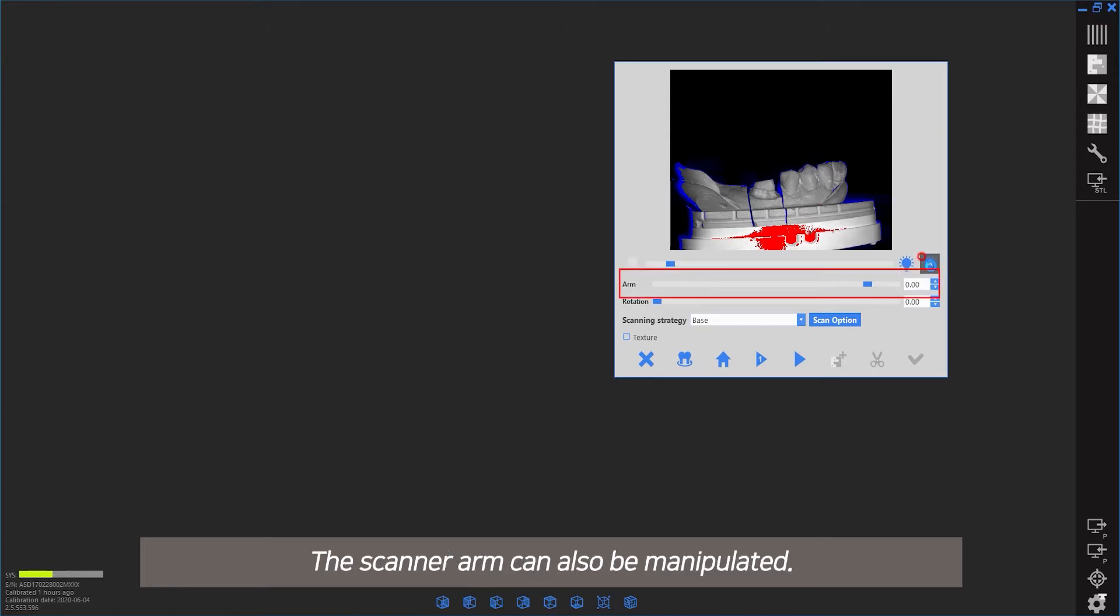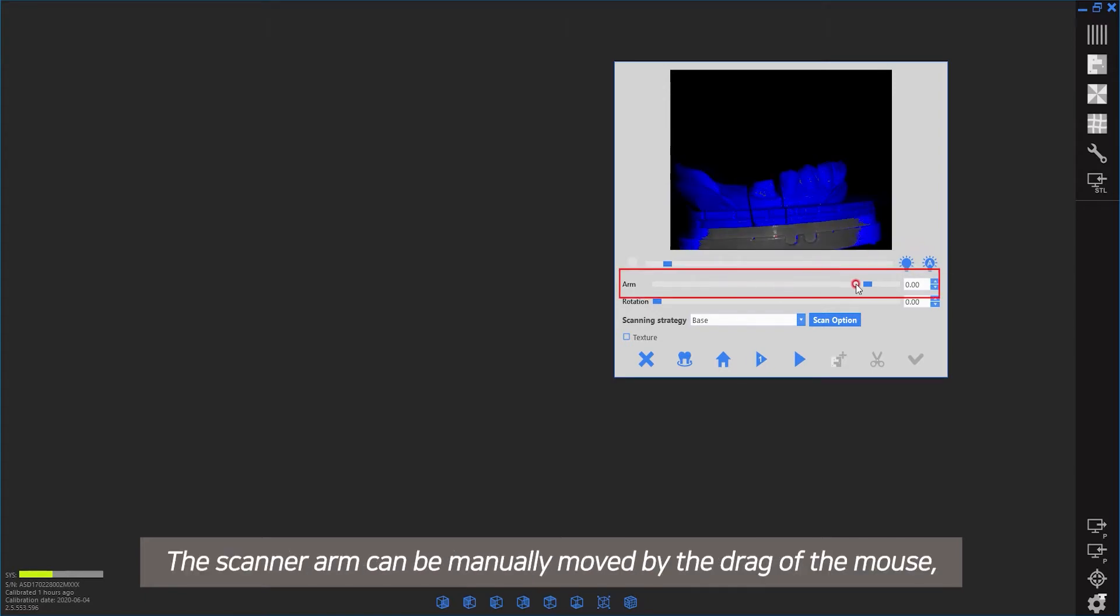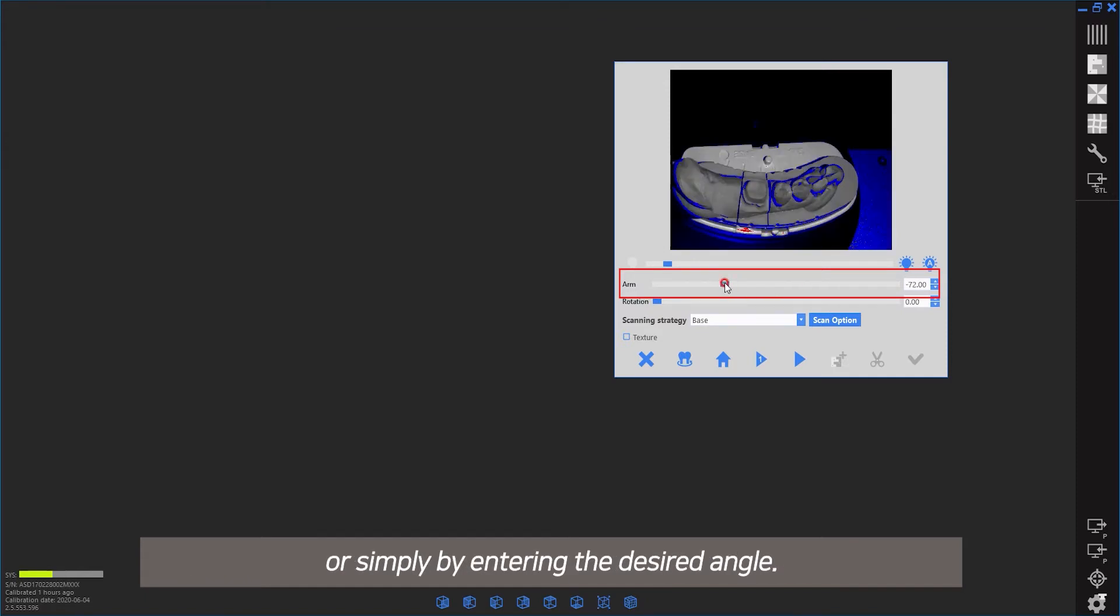The scanner arm can also be manipulated. It can be manually moved by dragging the mouse or simply by entering the desired angle.